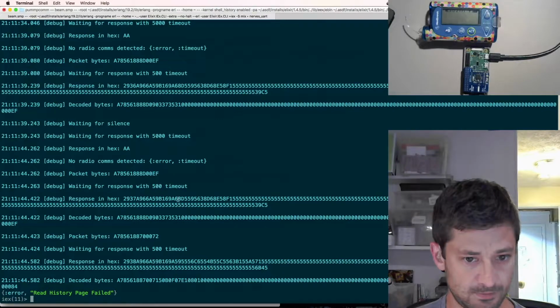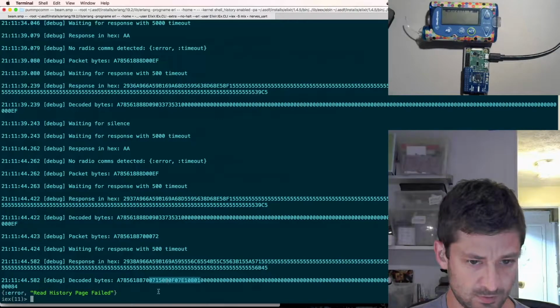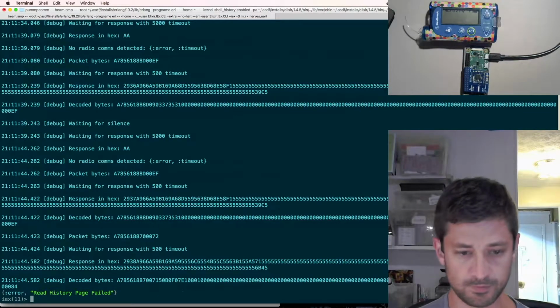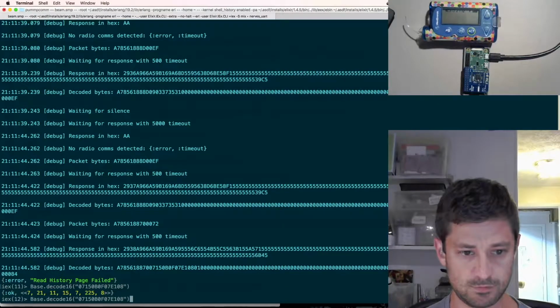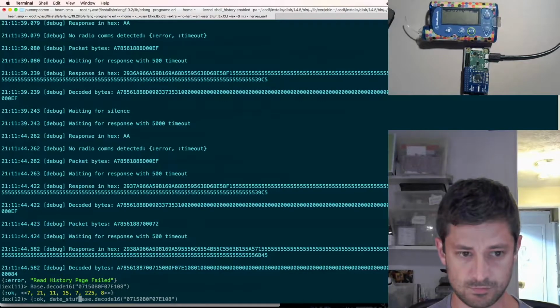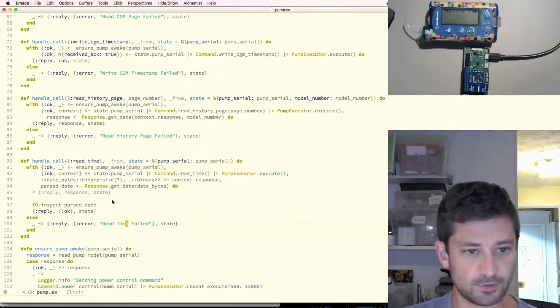All right. So I got a response back that looks pretty okay. And that makes me wonder what happened. And I'm wondering if I'm off by one here. All right. I'm just going to try to call this directly on the date decoder.